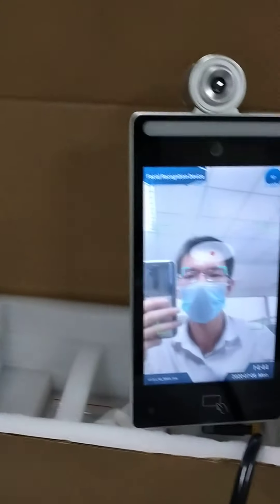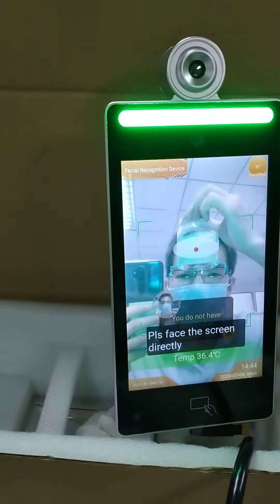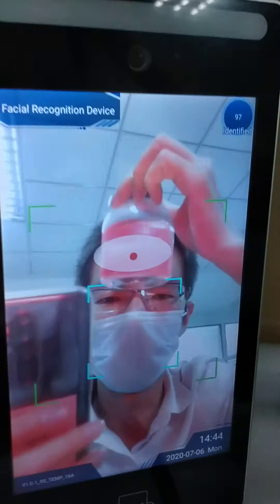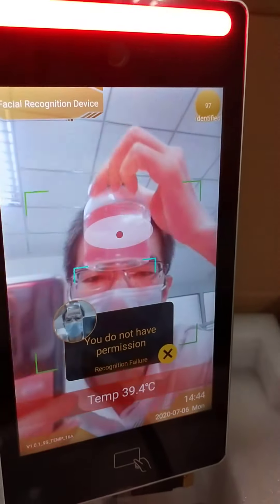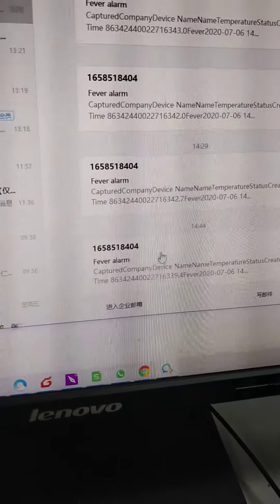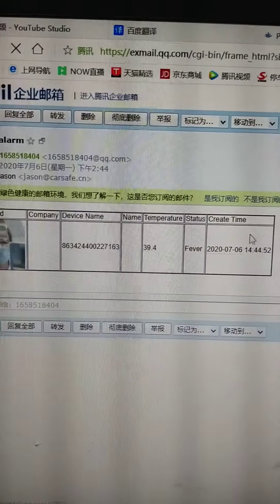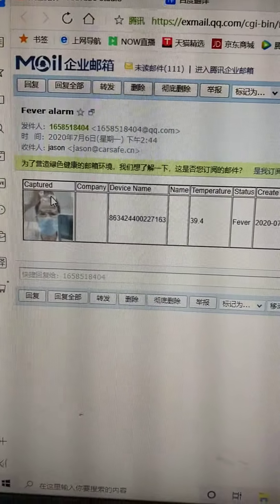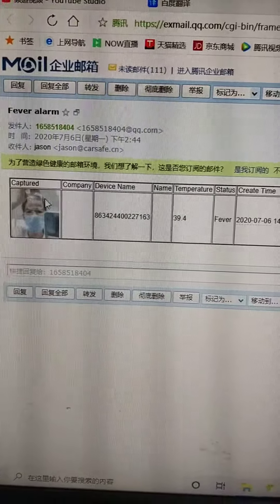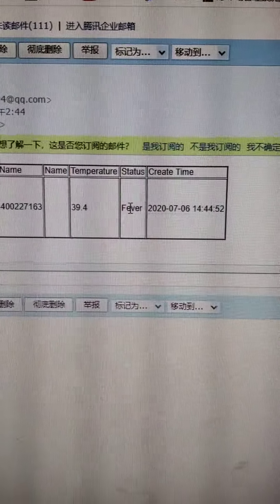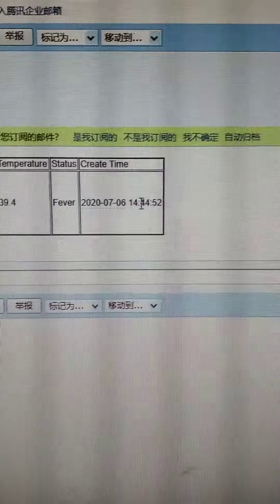Now let's check it. The machine is alarming. Now here comes the email — the fever alarm email. Open it. Then you can see the photo of the person, their temperature, their status as fever, and the time.